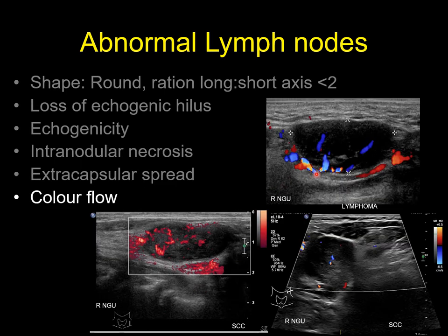Colour flow can lead you to make a diagnosis of abnormal lymph nodes. Here is an aberrant-looking vascularity in a lymphoma node. Here you could hardly see any vascularity — this was in an SCC node. Here again is an unusual pattern to the lymph node. You would expect a normal one to have flow through the hilum, but here the hilum is missing and the vascularity is unusual.